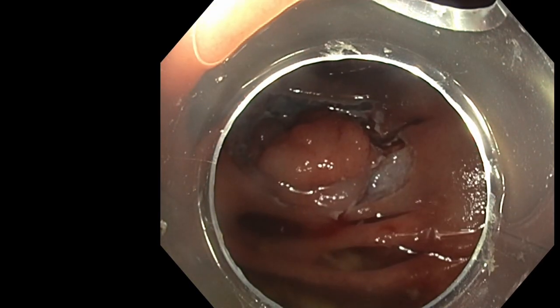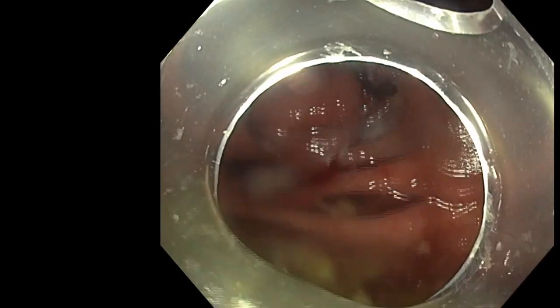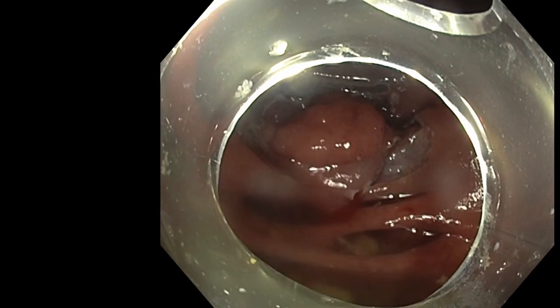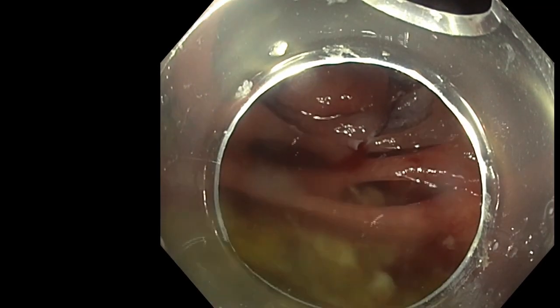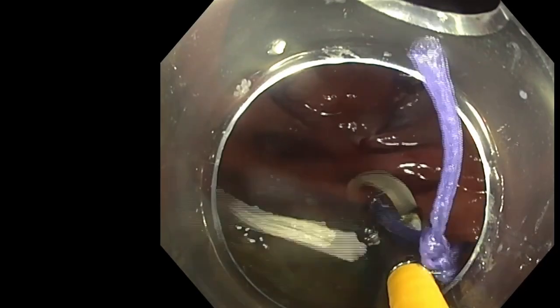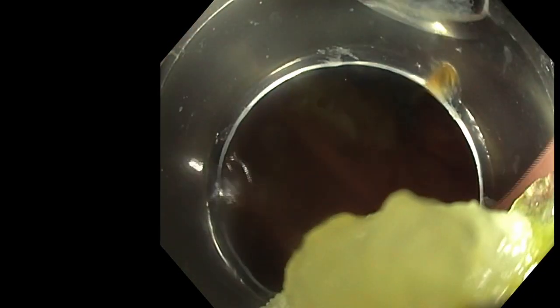it was possible to introduce the traction device. So yes, the lesion is not so big, but using EMR in this case will not lead to a complete resection, because it's impossible to reach the bottom of the diverticula with a snare, because the bottom of the diverticula is deeper than the bowel wall. So for me it seems impossible to have a complete resection using a snare in this case. So here you have the residue coming and slightly preventing the good way of the resection.